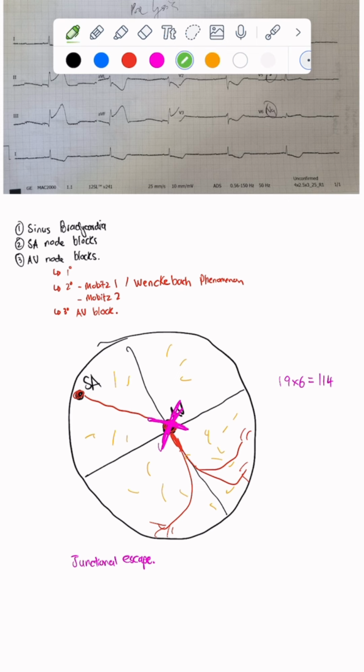And remember I spoke about the heart wanting to follow the leader. So the atria typically still follow the SA node, who is still the leader. But those impulses are not able to get to the ventricles. So the ventricular cells decide, okay, we need a new leader. You can either have a group of cells in the specialized conduction tissue, and we call it junctional escape, or within the ventricles, and we call that a ventricular escape, right? Generally, junctional escapes are going to cause narrow complexes. Why? Because they're using your specialized conduction tissue, whereas ventricular escapes are going to go from one myocardial cell to another, and that causes broad complexes, right?